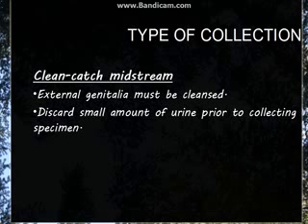Now the types of collection: they can be clean catch, midstream sample. In this, the external genitalia must be cleansed by the patient and a small amount of urine is discarded prior to collection of the specimen so that external urethral infection cannot play a role.